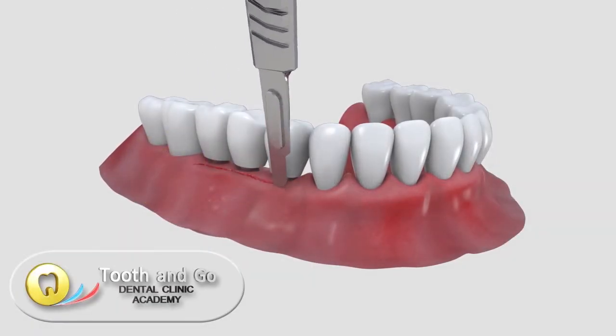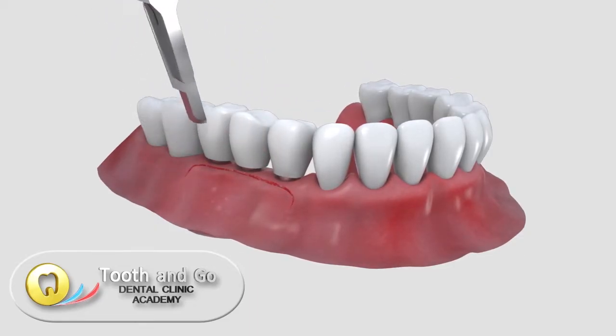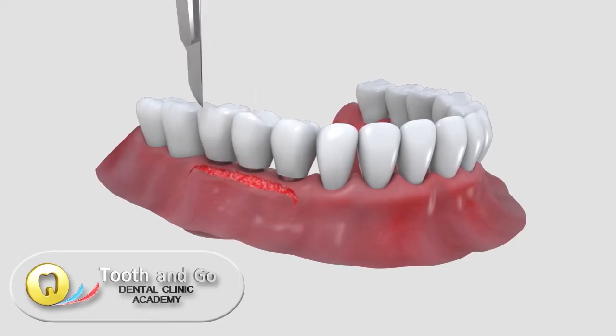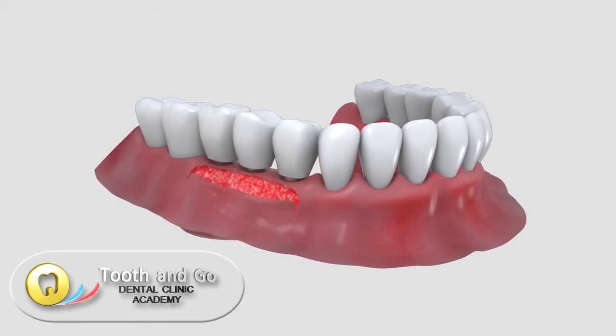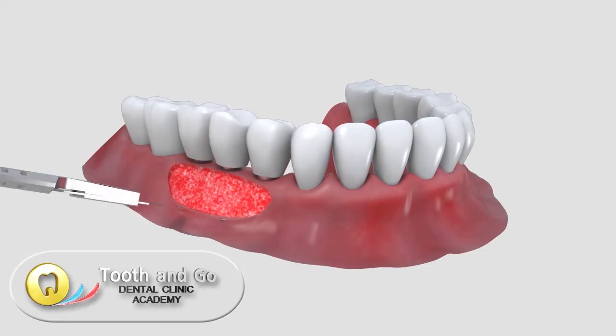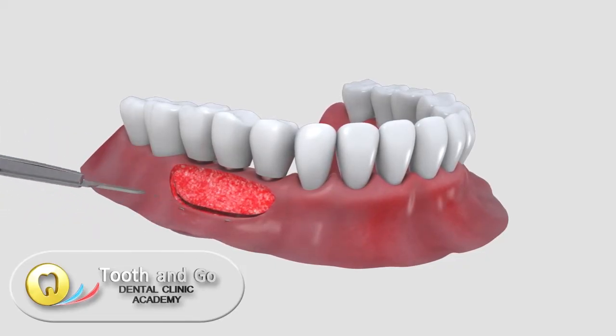A free gingival graft improves the gum condition around implants in cases where there is non-attached gingiva around the implant. The remaining mobile connective tissue will be completely removed.